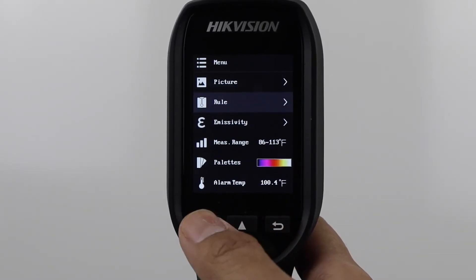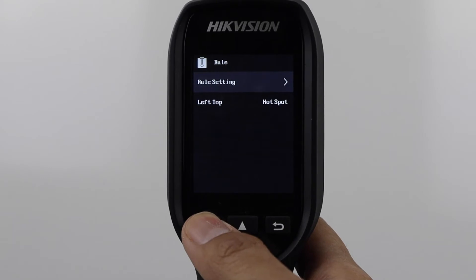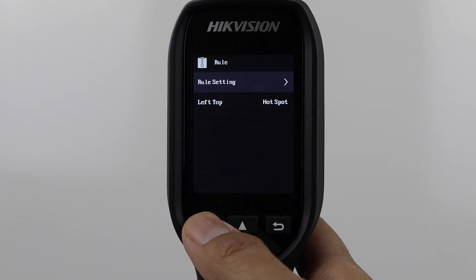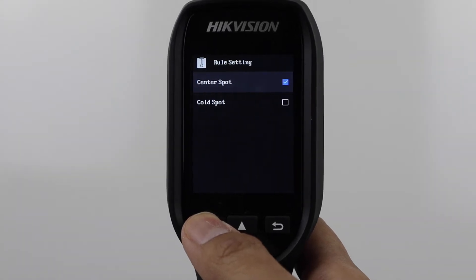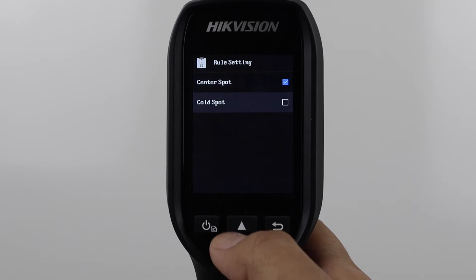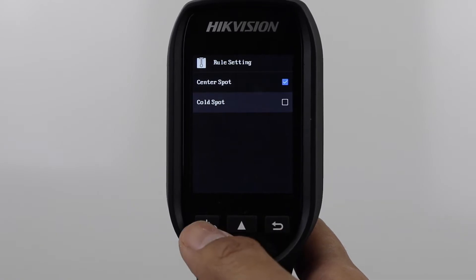Next is Rule. This represents the measurement rule you are using. We have Hotspot selected, which will automatically locate and measure the hottest spot in the scene. This is usually the best choice for body temperature screening. However, this setting won't work if you have hot objects in your background.